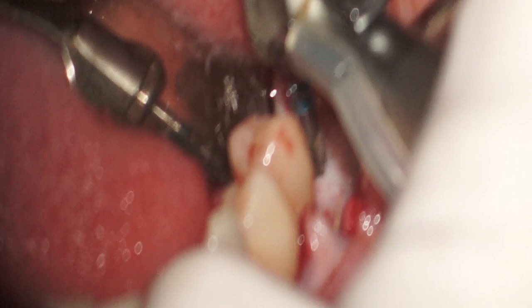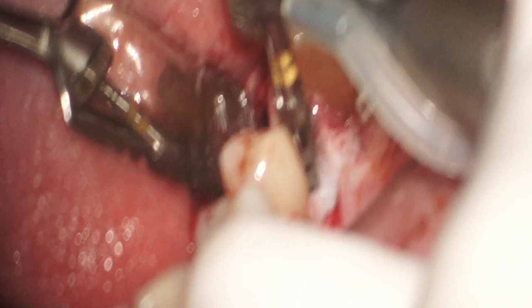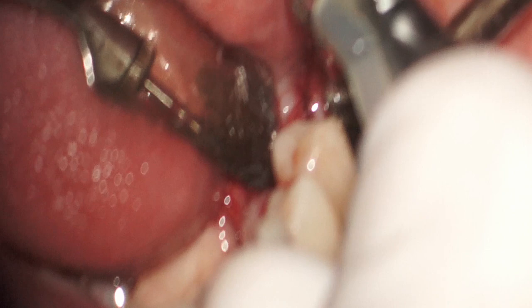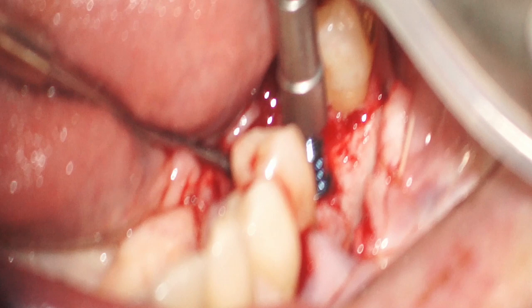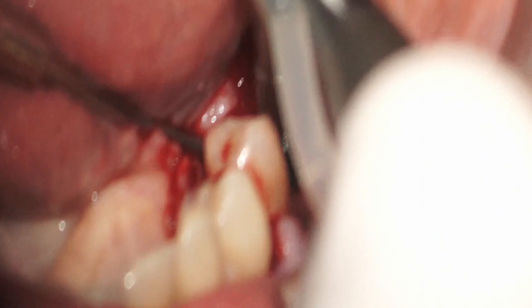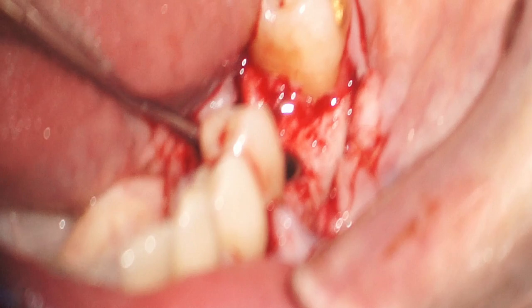Even by four months post-healing, we're seeing resorption and replacement of bone replacement graft materials, which translates clinically to what looks like vital bone — most of the bone particulate is also covered by vital bone. In this case, with an out-of-town patient, it was about six months before we got to implant placement. Here we can see the implant being placed into approximately Type 2 bone, and the fixture stops sharply at 45 Newton-centimeters at the depth of placement. We've established not only adequate bone volume but excellent bone density, which works well for implant placement. We'll then proceed with approximately three months of implant healing prior to the restorative phase.